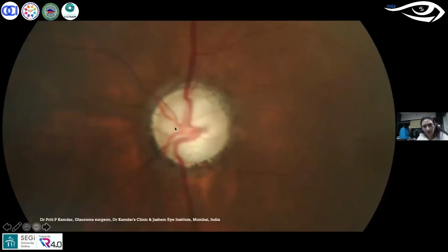Now when I take you to the next, now you can say that yes, the optic nerve shows advanced glaucomatous damage, and now the fourth answer becomes true, that it is an advanced glaucomatous damage because it is correlating with the disc which shows advanced glaucomatous damage. So I hope you have got this one thing clear, that there was an RAPD because there is an unequal damage. It's a strong localizing sign. One. Second is, you should describe the field, give a diagnosis based on the field only and only after seeing the full clinical picture, that is the retina, the optic nerve.